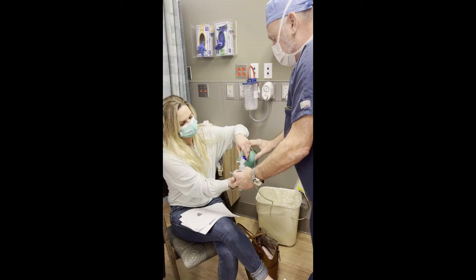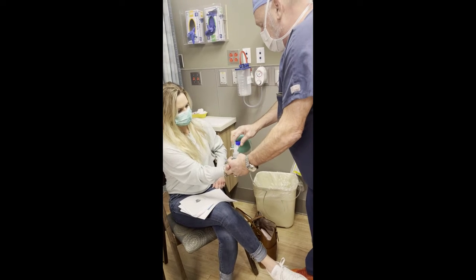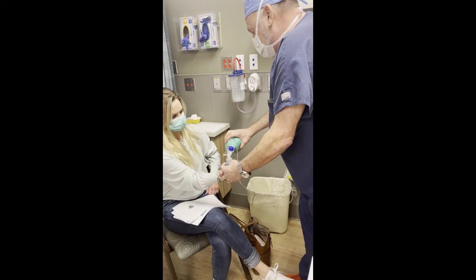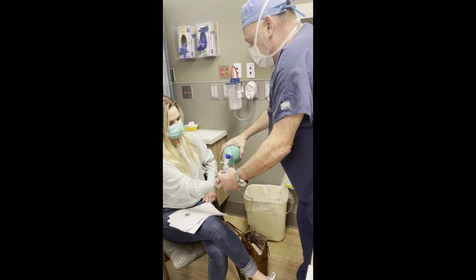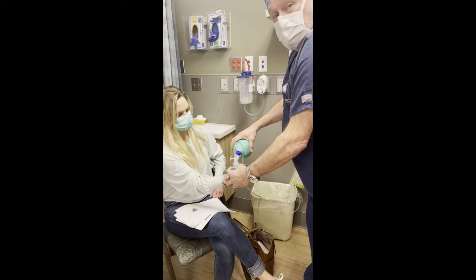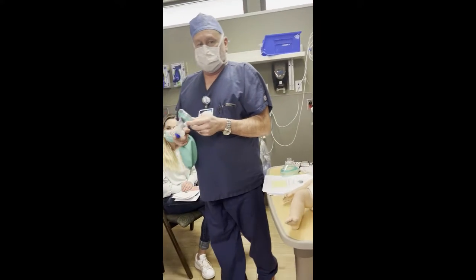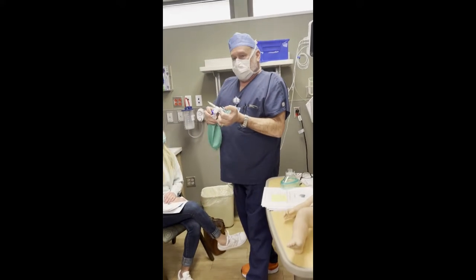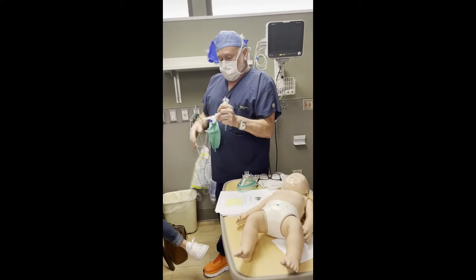So when the baby breathes, you want to be able to let him breathe. So you don't want it all the way closed because that's too tight. So you set it so that when he breathes in and out, you do that. The other thing is when it's closed, you can give a breath. So it doubles as an ambu bag. Okay. When you need to break that laryngospasm, you make that valve tight on their face, like I showed you when I put the mask on.